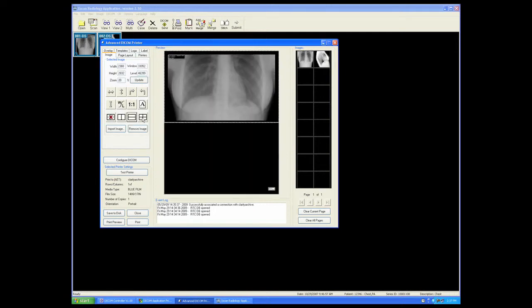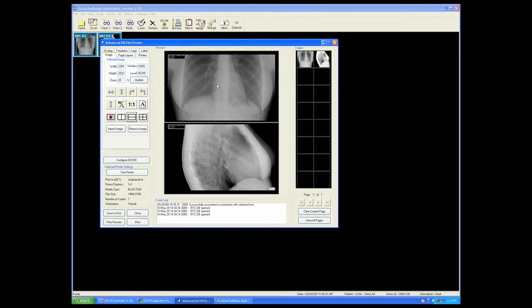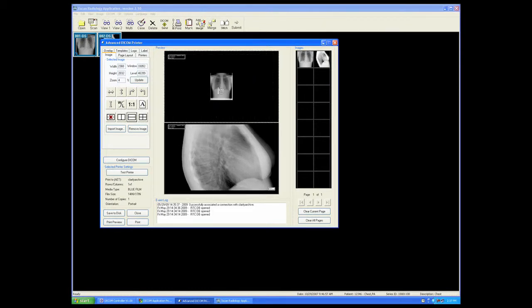And we can zoom, magnify window and level.